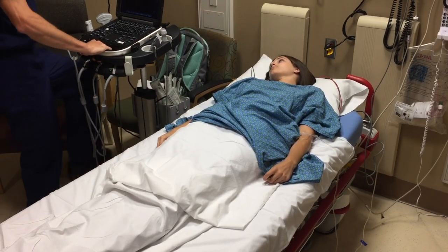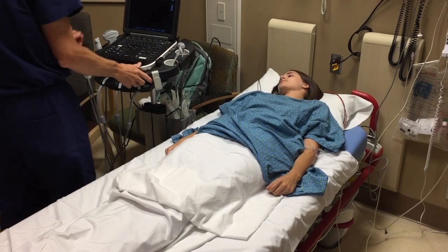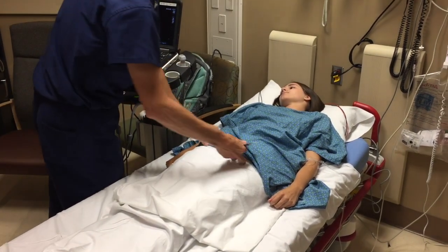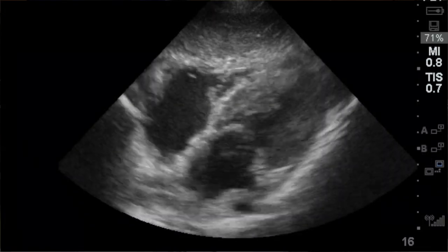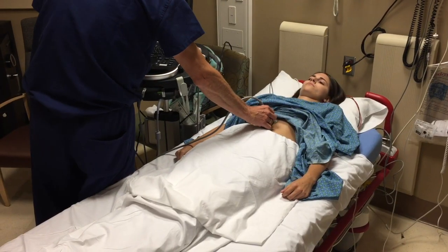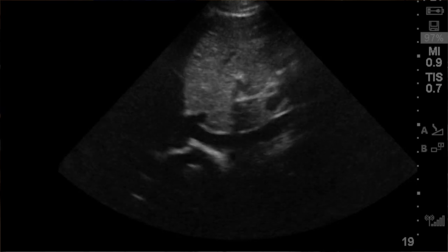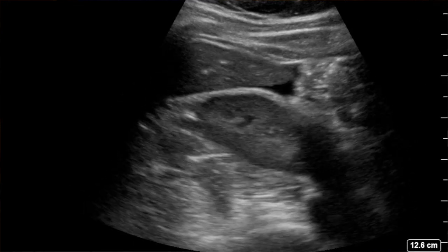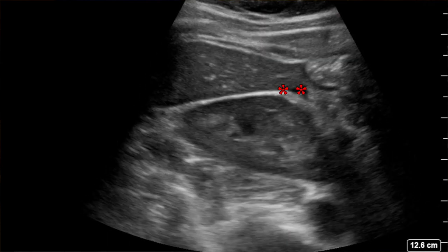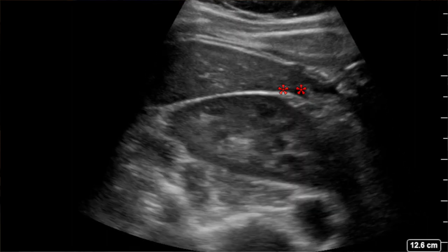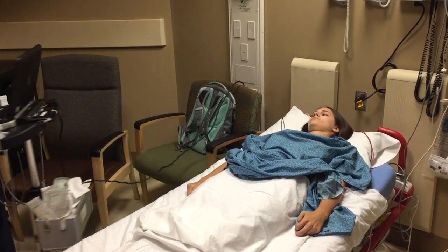Next patient — no English. Let's use ultrasound and go to HI-MAP again. Heart is hyperdynamic, contracting very vigorously. IVC is totally flat — there's a volume problem. Let's look at Morrison's pouch. Oh wow — there's a big stripe of free fluid there. That's never normal in a young woman. Free fluid in the abdomen — that's ectopic until proven otherwise. Let's call for blood, get some IV fluids going, and I'm going to page OB.